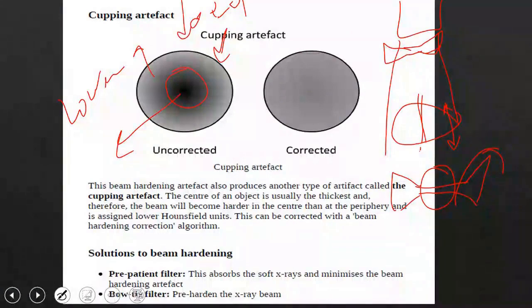So you are doing equalization for the X-ray when you send this data to the detector, which does something called normalization. What is normalization? It means that I am now looking for where the highest pixel is and where the lowest pixel is. Then it says, my highest pixel, or highest intensity, or highest signal reached its value like this, and the lowest signal reached its value like that. So my grayscale is in this range.